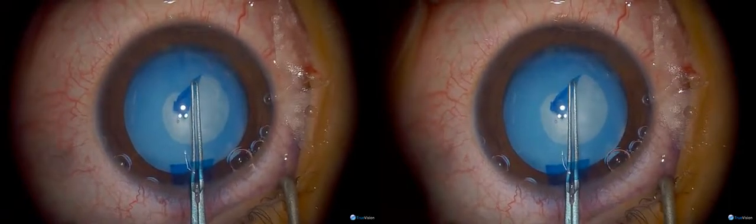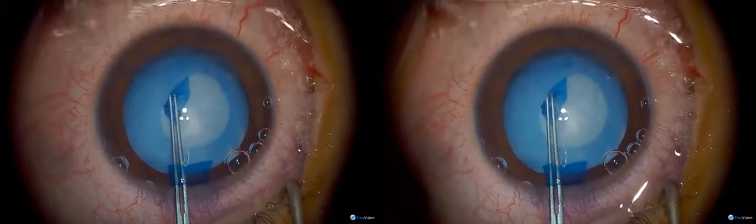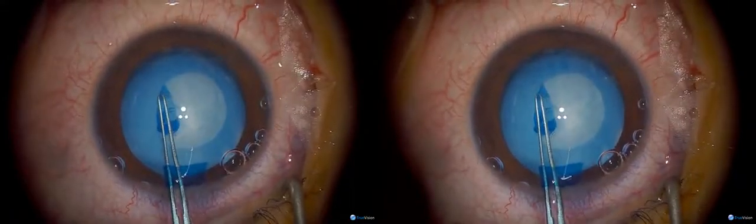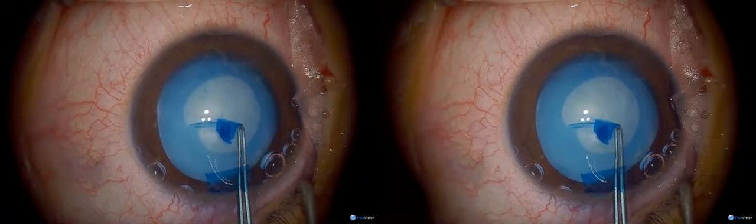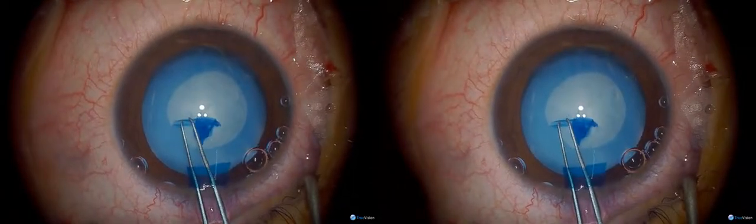Every now and then you have to pull it backwards just to get the trajectory right. His mother noticed this a couple of weeks ago, but my guess is it's been there a lot longer because it's quite a dense white cataract. With these pediatric cataracts the capsule is much more elastic than usual, and the vision blue helps to stiffen it up a little bit.